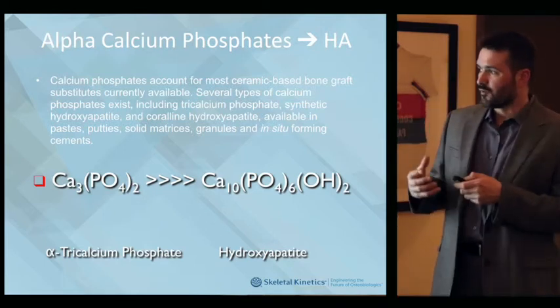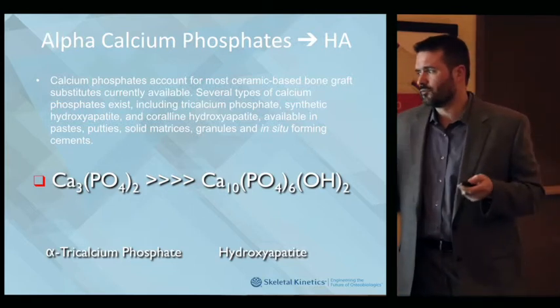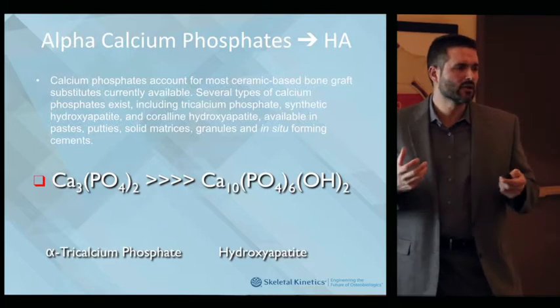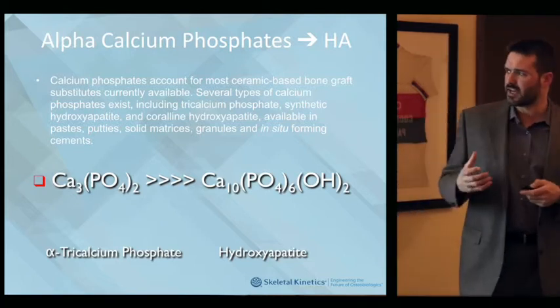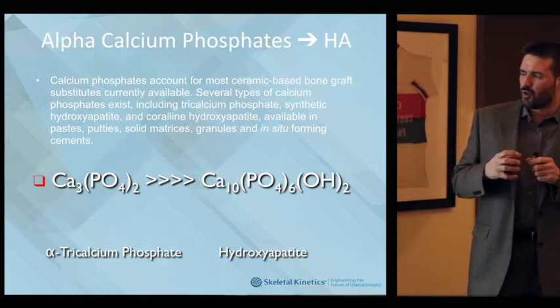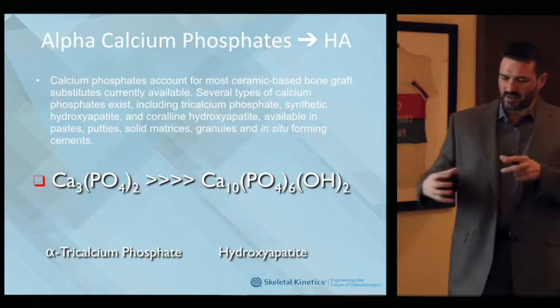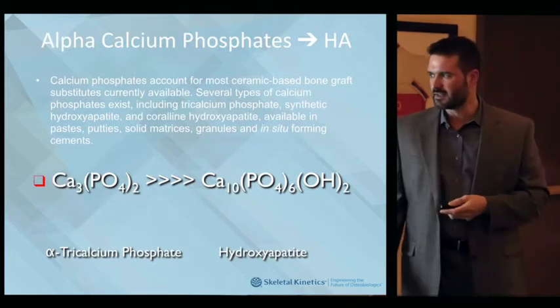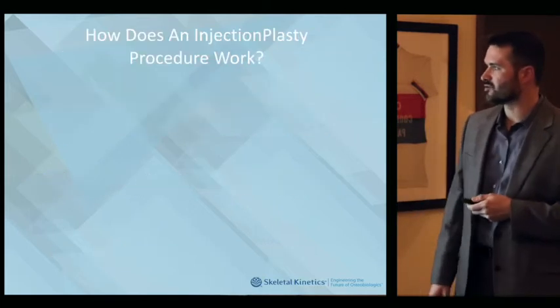And then you fill the void, and within 24 hours it hardens. And it's like cement. Now, the way I look at it, it's like a scaffold your body builds on. And I don't know the science specifically, but obviously with all that fluid there normally, this substance kind of pushes that fluid out so the body can build there. And I think that's the great part about this substance. So this is the chemistry behind it.